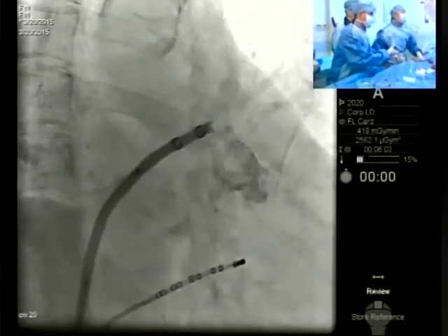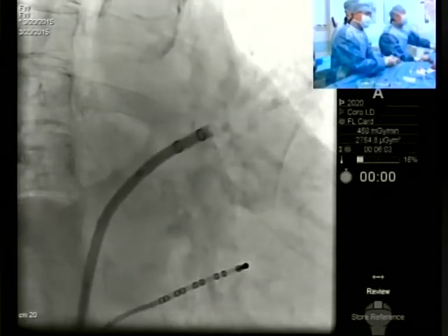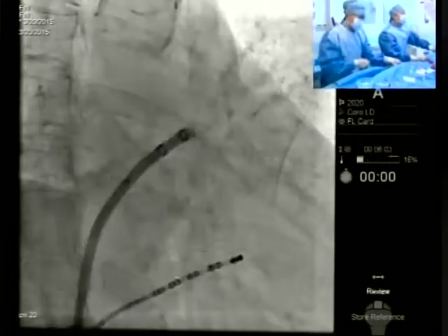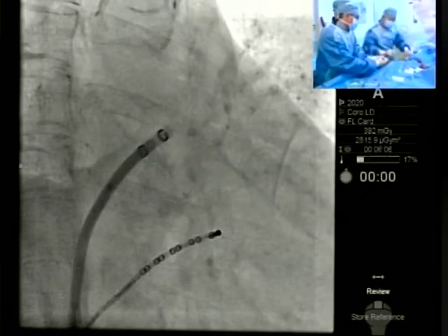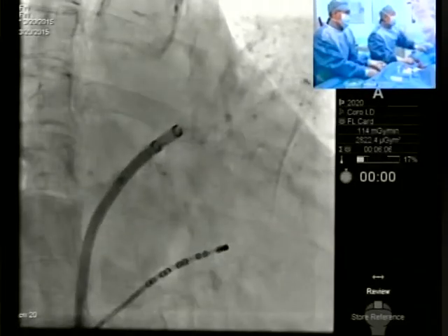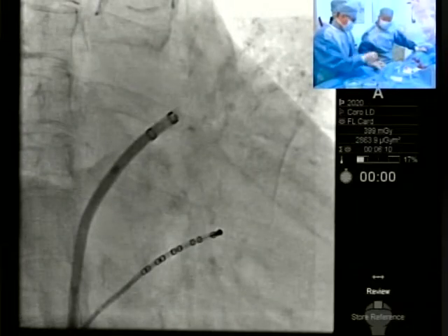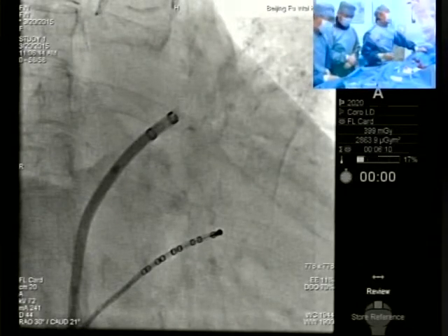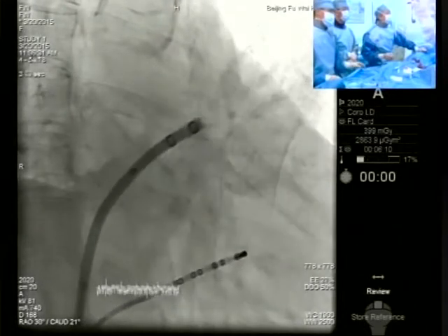So Horst just mentioned we can actually do this entirely under local, because if you're familiar with transeptal puncture, that's okay, because the demand on the exact puncture site is less with this device, because you don't have to deep seat the delivery catheter. And then, of course, TEE can help you to check the stability and also the leak after implant, which I think Jarwin will show you. We don't need really TEE information also on these 2 aspects.